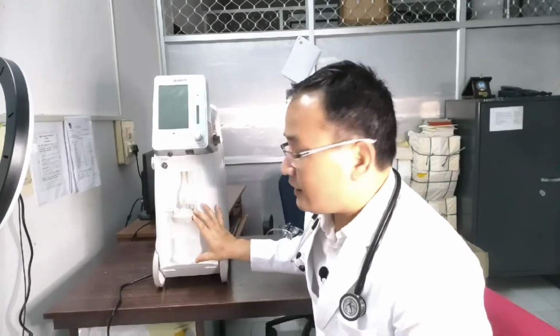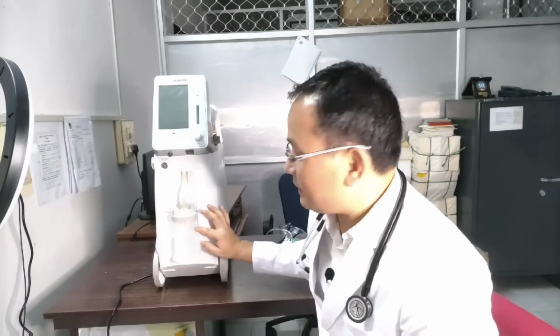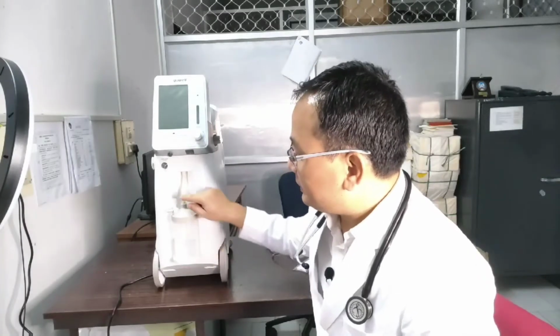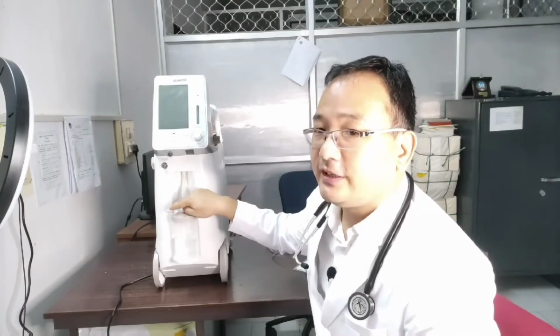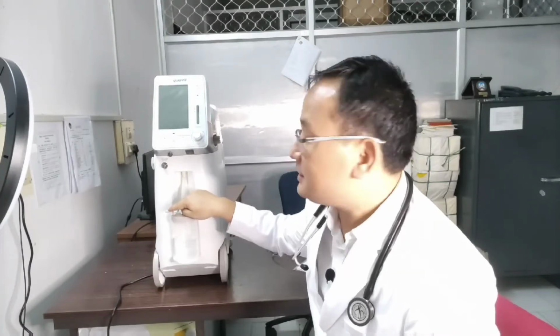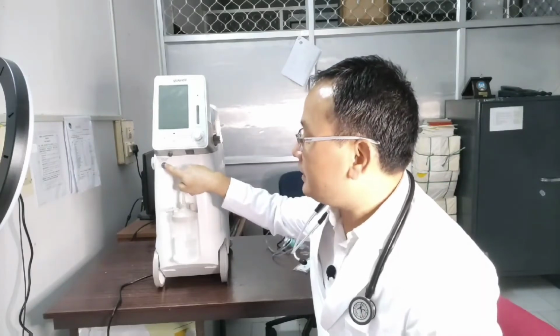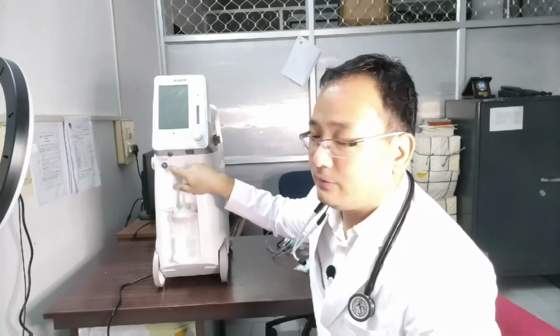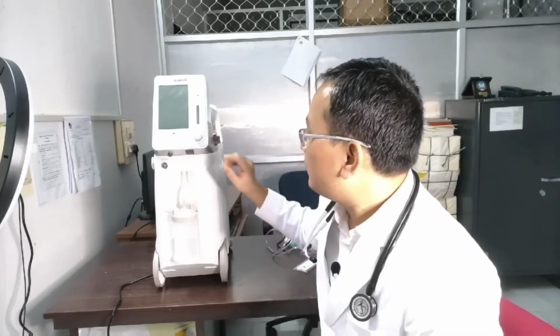This is the container which has water. There is a mark here, maximum level of water and minimum level of water, which should be maintained. This outlet is for oxygen. Here the tube which draws the oxygen is connected, and this point is the outlet for nebulization. The nebulization tubings are to be connected here.